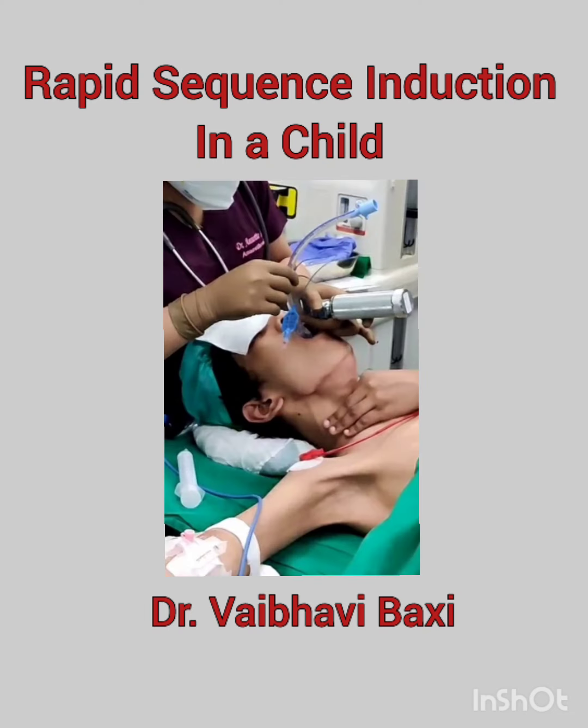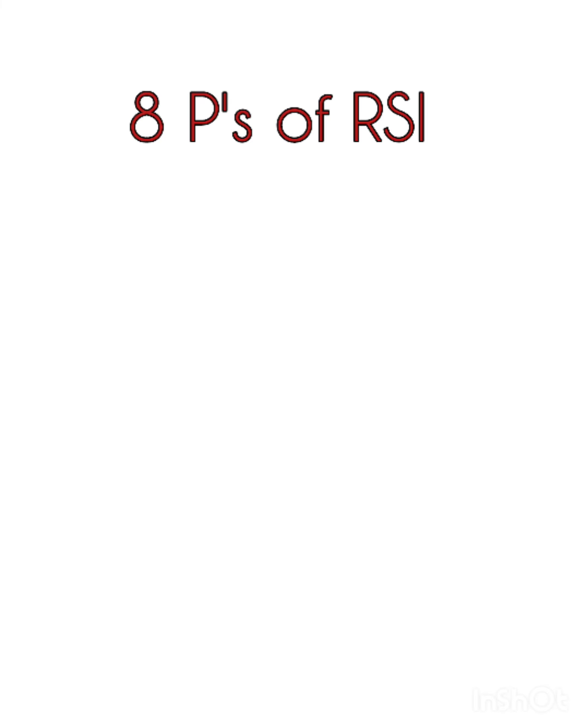Rapid sequence induction is an airway management technique where the aim is to quickly and effectively induce sedation and paralysis and insert the endotracheal tube into the trachea as quickly as possible, and minimize the risk of hypoxia or patient vomiting and aspirating. It is done for patients who are at high risk for aspiration and impending airway compromise.